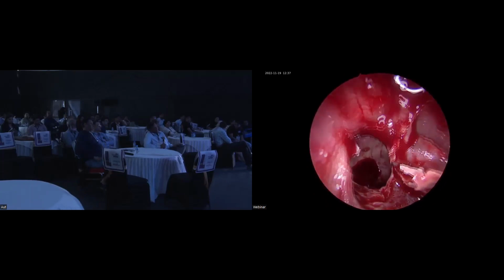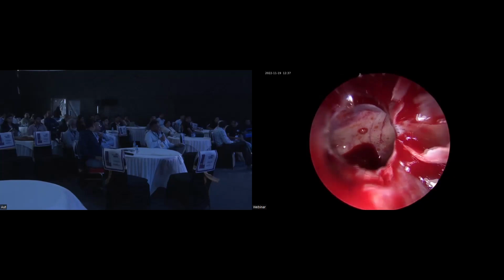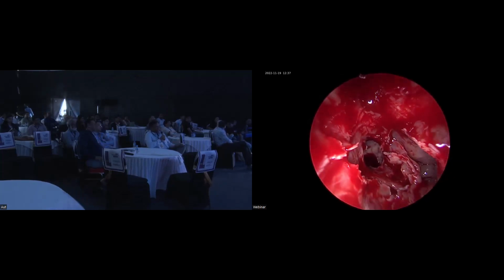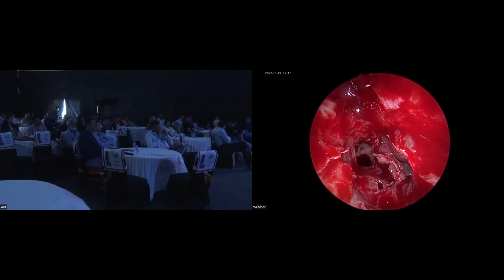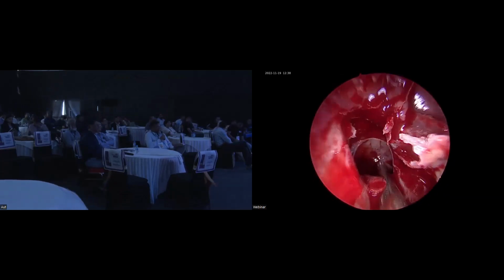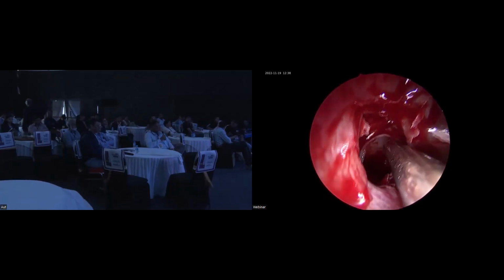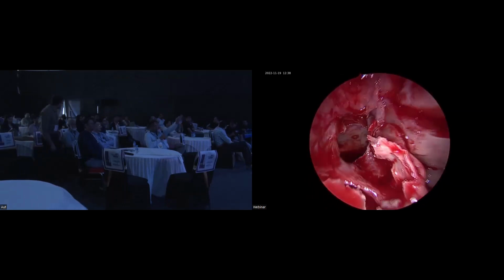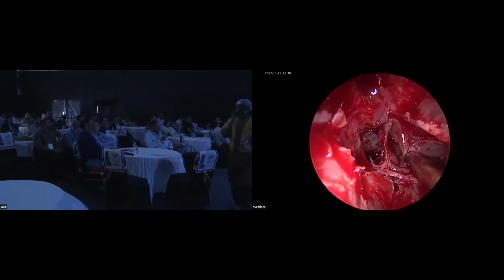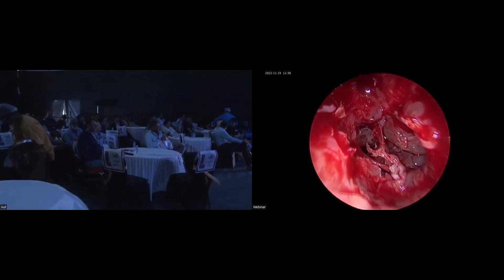You're already seeing the landmarks section. Yes. Then please, you can see the Onodi cell. So inflammation, because of Onodi, the sphenoid is pushed down. You are already seeing the optic nerve now. Sphenoid. This is the optic nerve, Onodi is lateral. While discussing the scan, we had already talked about that there is probably a situation of Onodi.